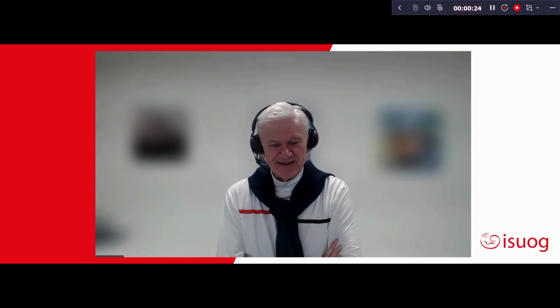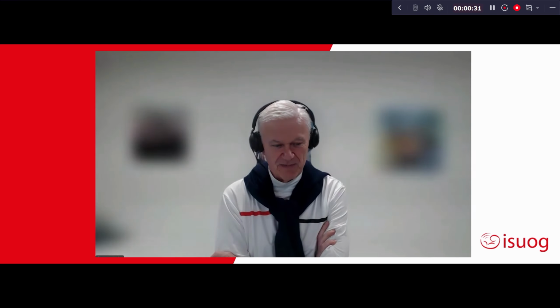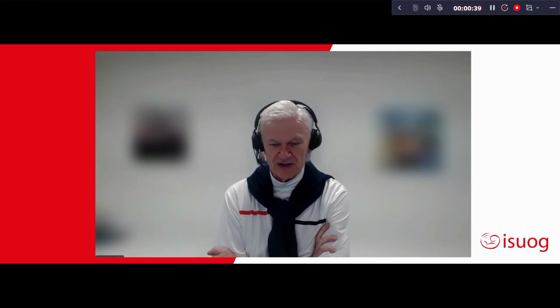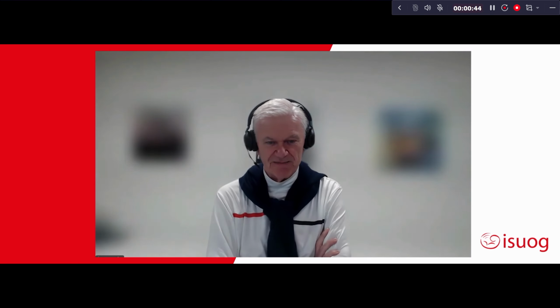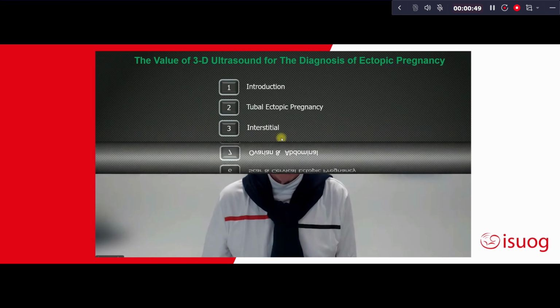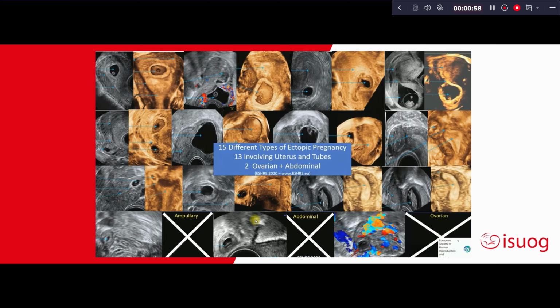My talk is on the classification, diagnosis, and differential diagnosis of ectopic pregnancy. I'll not be focusing on management, but rather a sonographic approach and clues to diagnosis and differential diagnosis when faced with common and rare forms of ectopic pregnancy. So I'll start my talk now. The talk is divided into the following sections: an introduction focusing on tubal ectopic pregnancy, then the rarer forms of ectopic pregnancy, and finishing up with some summary and comments.